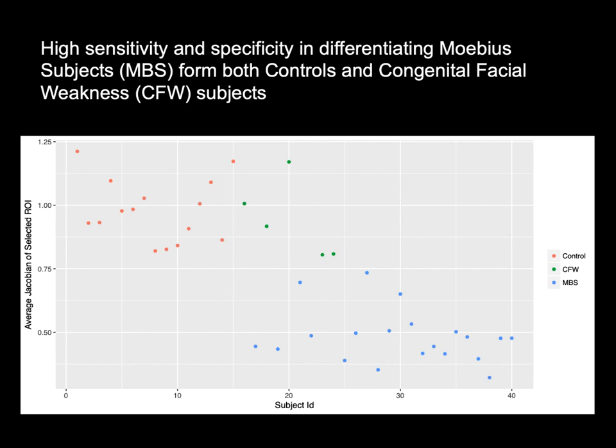Then you can do the statistics on the determinants of the Jacobians of the individual subjects that belong to each subclass. That is probably the best thing to do if you build the template with your own data and you have two groups: a population template built from the combination of both.